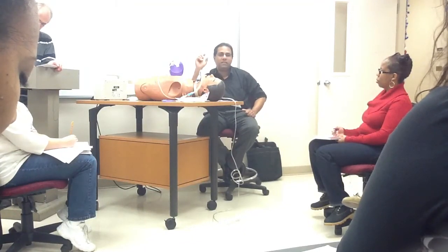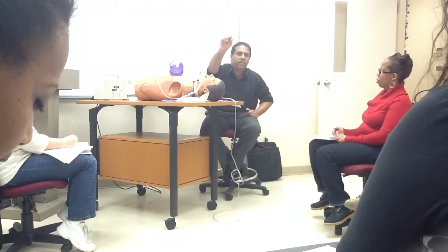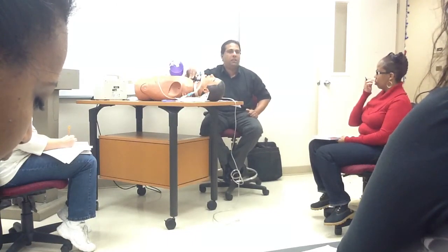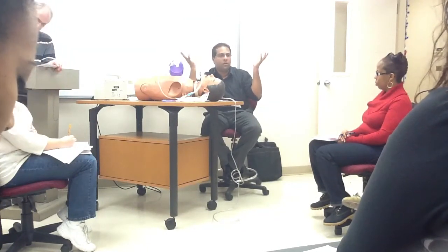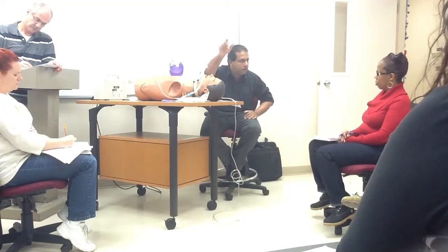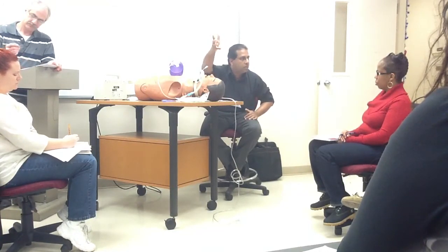So not all the patients are good enough. You can just go over there and turn the FiO2 up to 100% and start suctioning the patient. But look at the patient. If their pulse ox is at normal levels and they're breathing normally, and you want to hyperoxygenate them, just turn the dial on the aerosol bottle up to 100%. Even if they're reading 98, 99% on the pulse ox, you can still bump them and give them a little bit more. If they are not taking nice deep breaths, yeah, you take them off and bag.